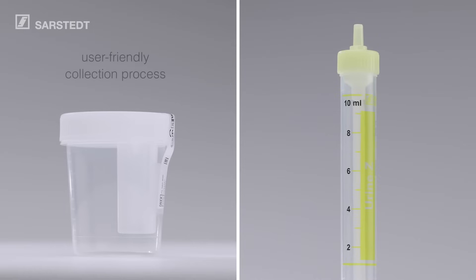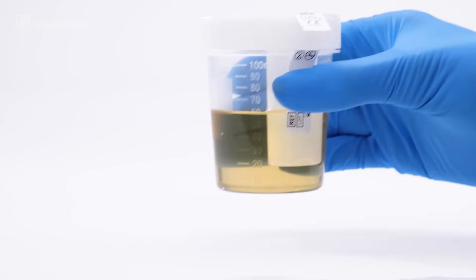The combination of Urine MonoVet and NFT Urine Cup makes the collection process particularly user-friendly. And it's as easy as this.